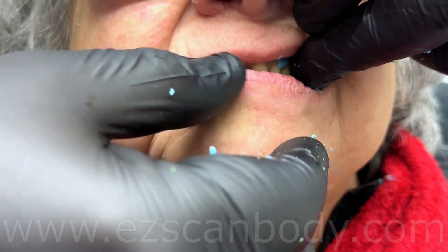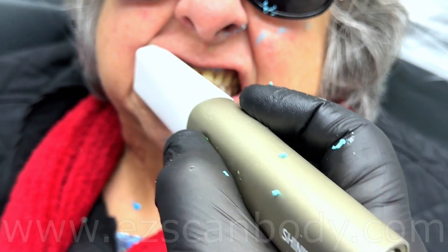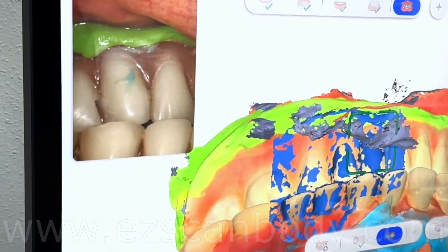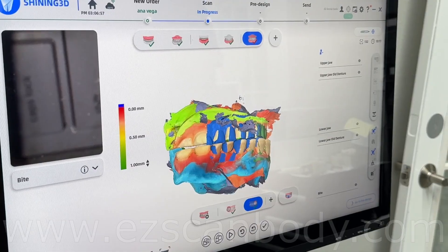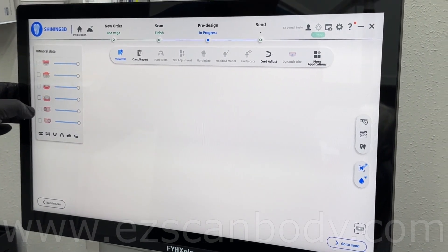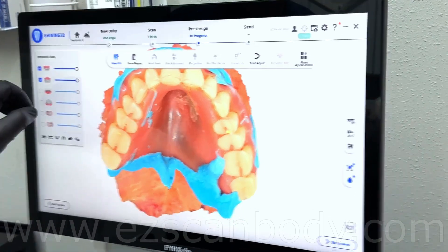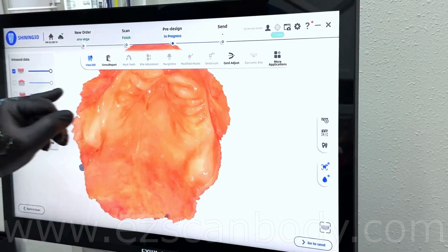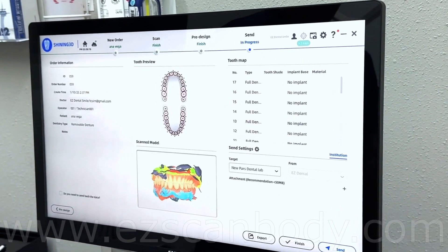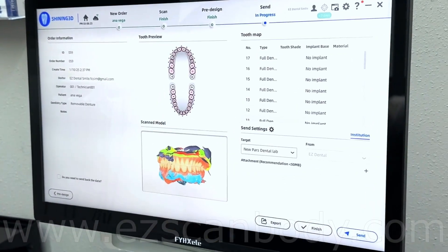Place the denture back and scan the bite. As I mentioned, we need only the jaw relationship at this point. Make sure your patient moves and closes the lower jaw as far back as possible. We need to transfer the jaw's relationship to the CAD software and fix the occlusion there. At the end, check all the scans to make sure nothing is missing. If you can get a good scan from the patient's gum, then you do not need to re-line the dentures — use them only as bite records. Save the scans and export to your CAD software.